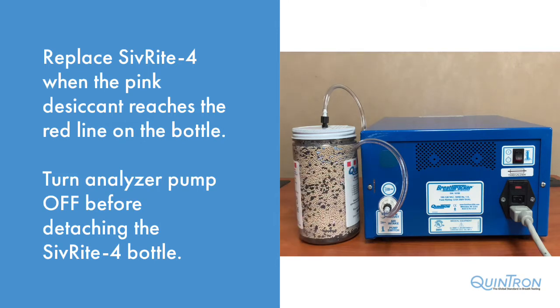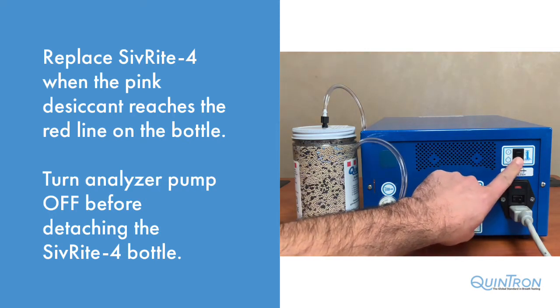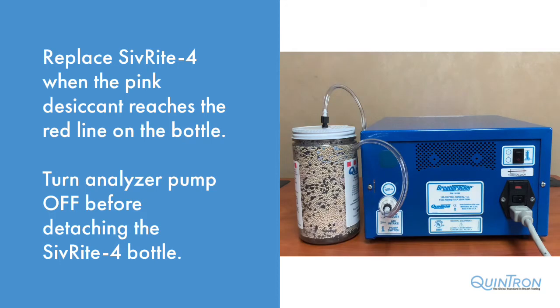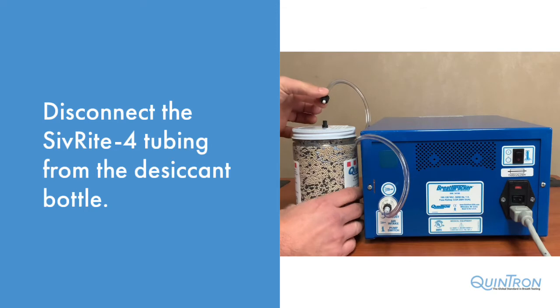The first step in doing so is to turn the pump switch off on the analyzer. Next, disconnect the Sivrite 4 tubing from the bottle.